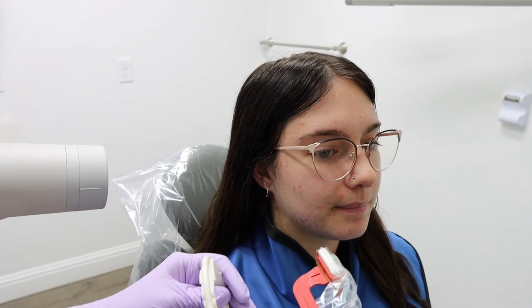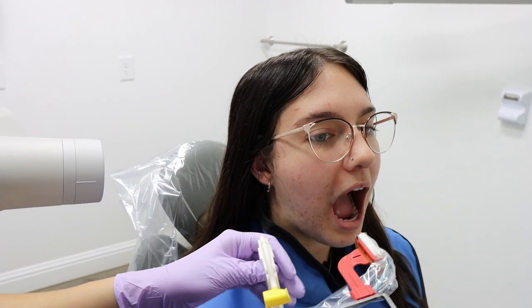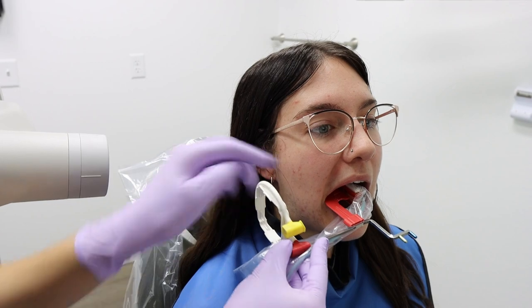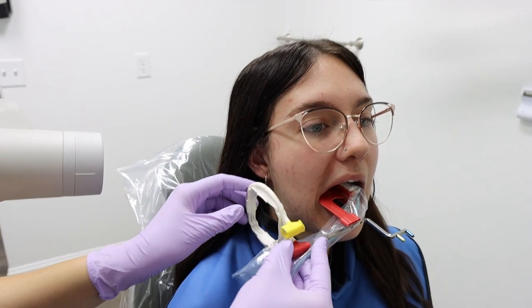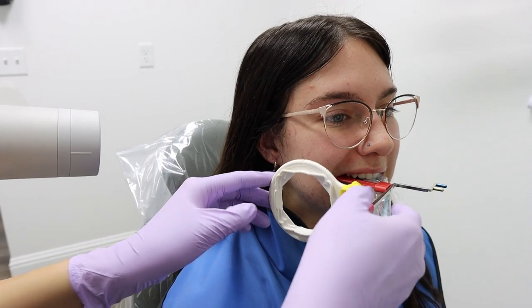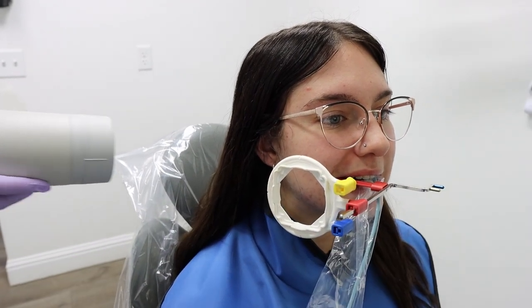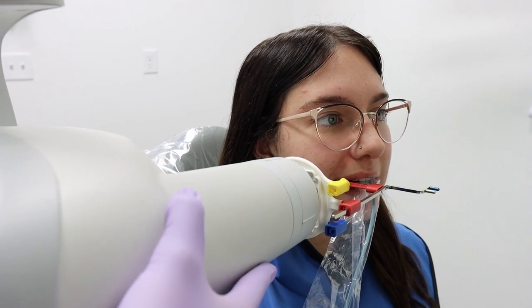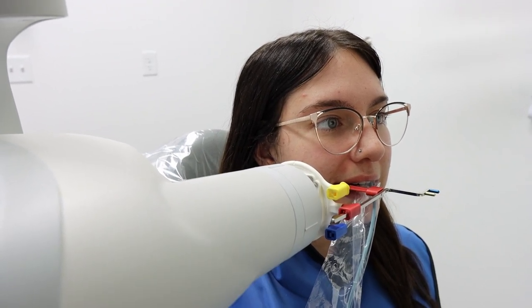Now we'll move to the pre-molars on the right side. Instruct the patient to open, and for this you want to angle the back of the sensor toward the anterior teeth and have them bite. Then again, bring the x-ray head over, angled down to 10 degrees, and line it up with the ring.